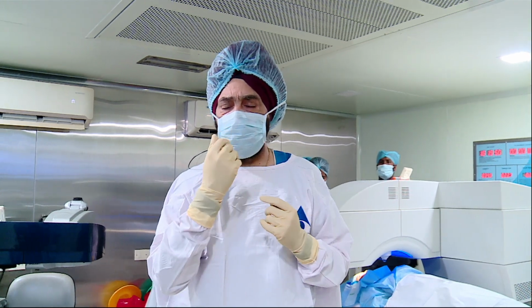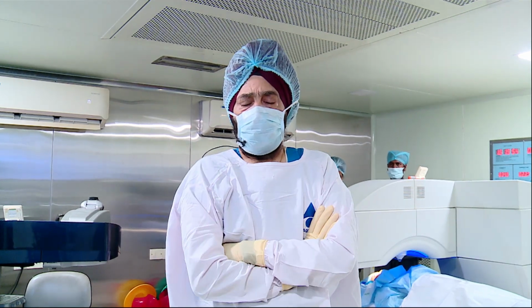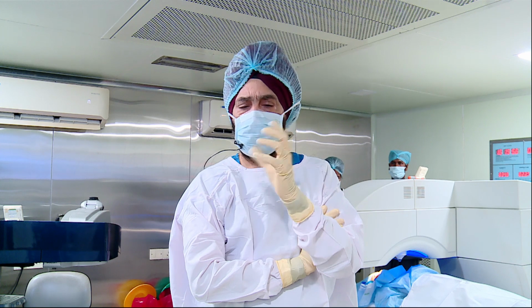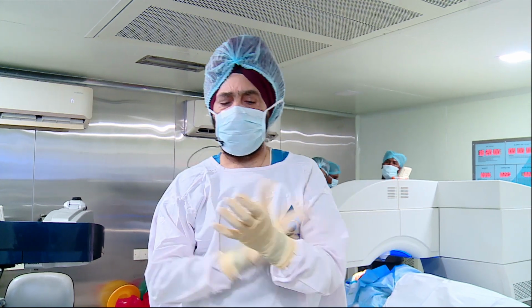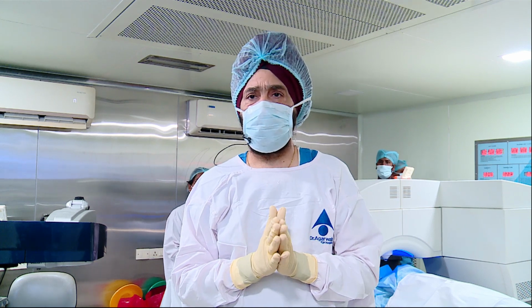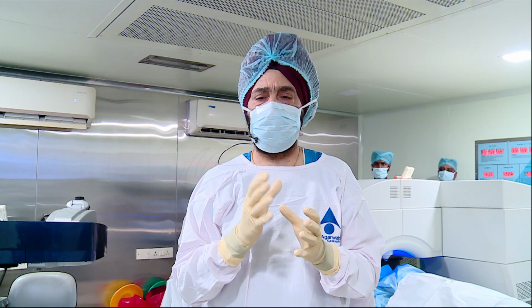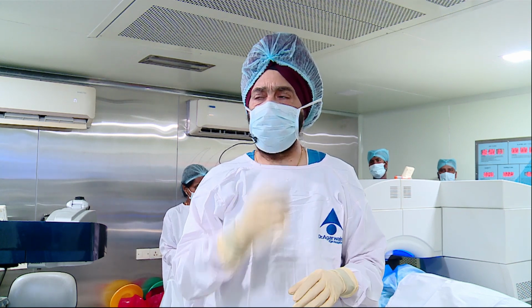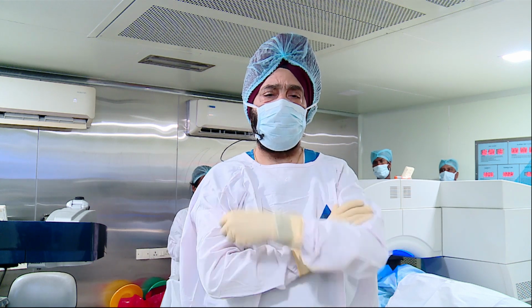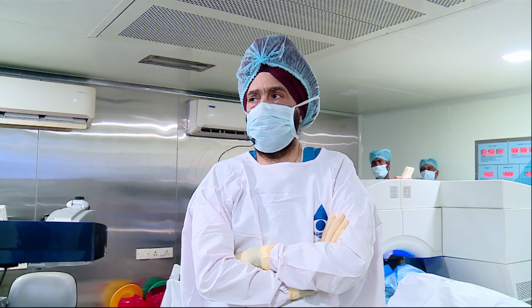And the other thing is, if the person has a prominent nose, you should actually turn the head a little bit so that the cone comes properly. And then for the centering, you should not press it totally or jam it on the eye immediately. You should just have a soft touch. And when you have about 70, 80, 90% of the applanation happening, then you press the suction so that it takes 100% suction on the area for the applanation. So these are a couple of these.